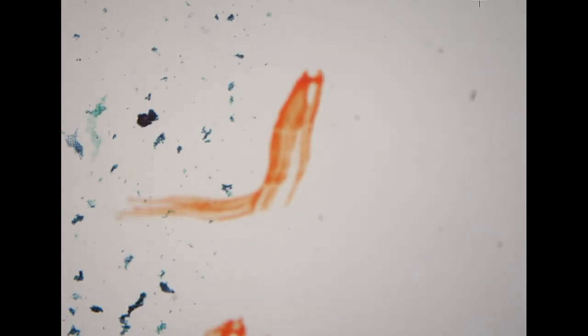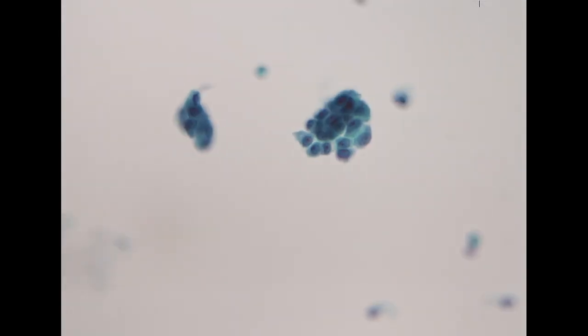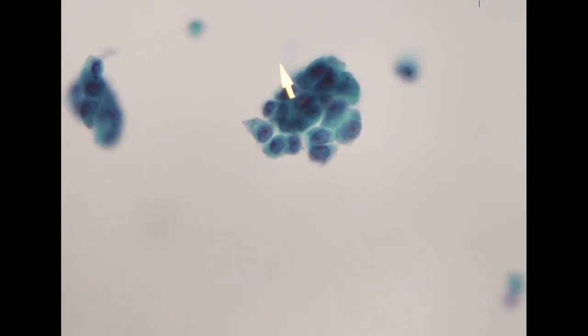So the next specimen is coming from a patient with a pancreatic tumor, and this is also from an EUS-guided biopsy. So in this specimen, again, we see mostly tumor cells. Sometimes we see a lot of tumor cells, sometimes we see a lot of contamination from the normal tissue, including the intestine and the normal pancreatic acinar parenchyma. So here we see a tight cluster, a little bit three-dimensional with polymorphism.